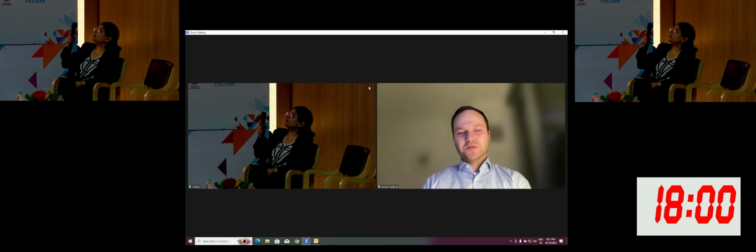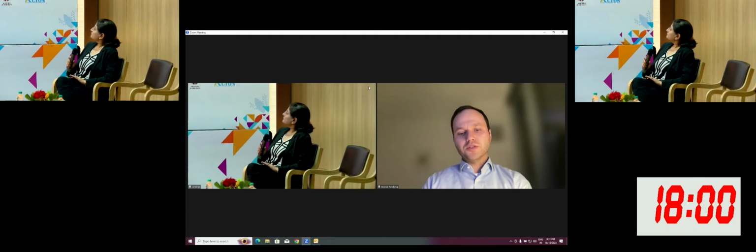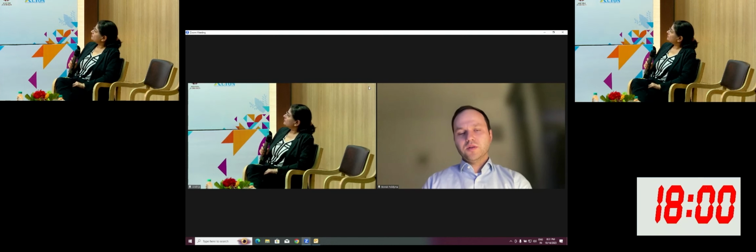Yeah, so we usually use the cutoffs that I showed on one of the slides. It's, I think, 2,000 for men and 1,200 or 1,300 for women. These are our thresholds. I heard the discussion. I think what's also possible, I don't know if it's done at your center on a daily basis, is to measure the AVA, the aortic valve area, and you can grade the stenosis with that as well. And I think you mentioned that the density plays a role. I totally agree, because the traditional Agatston score is 30 years old and it's weighted highly towards the higher density, and maybe a volume would be a better measure for the aortic valve if we are really looking at bulky calcification obstructing movement.